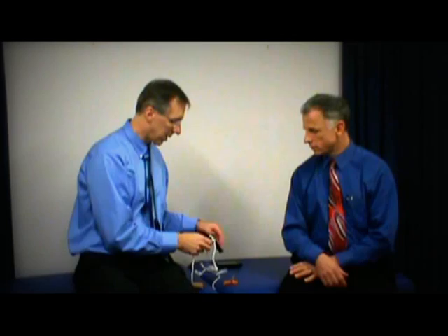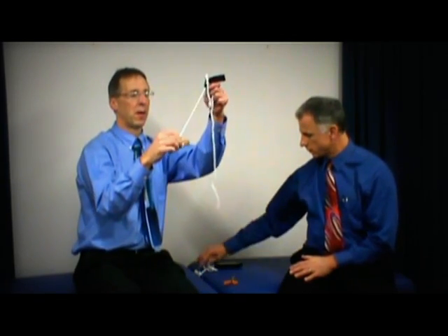Okay, and what kind of length are we going to need here, Brad? I would probably say about 3 feet or 4 feet. I'd go longer than shorter. Yeah, because you can always shorten it. You can always shorten it, exactly, maybe even 5 feet. It depends on how you're going to make the handles. If you're going to make the handles, so you're going to have this now.